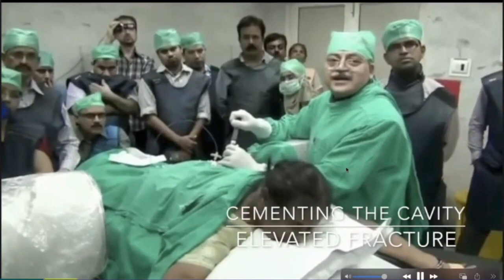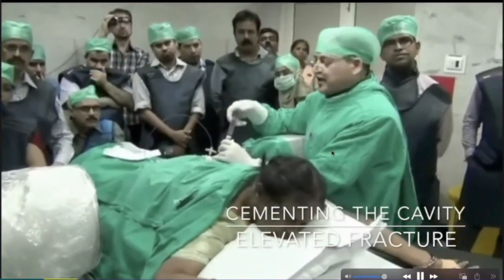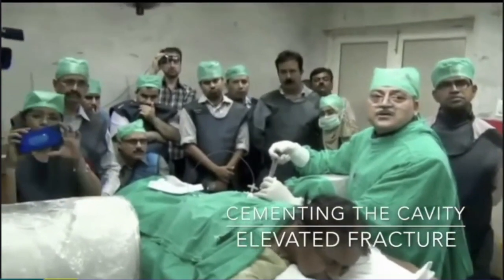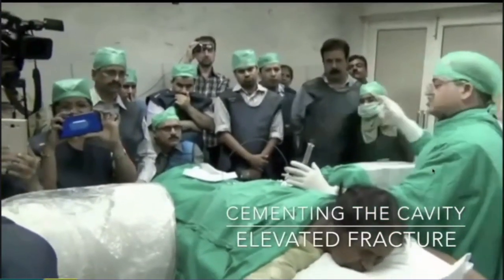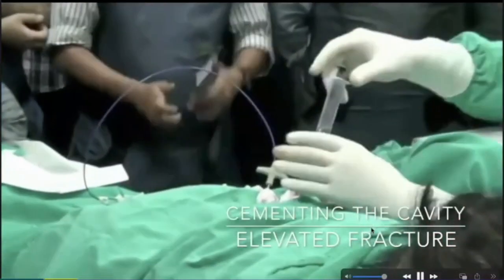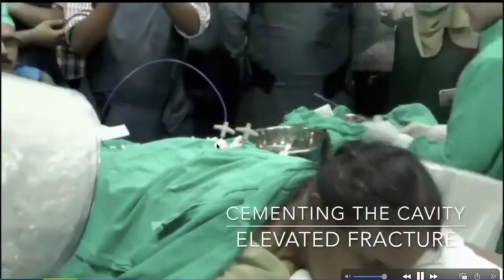You have to be very, very careful. But then you're more controlled because you have a cavity there. It tends to stay at the cavity area, so that's not a big worry. So that is to be looked at. And once it is there, clear the needles off. Always remember, clear the needles off. The cement might block this needle. You might have to change the needle.